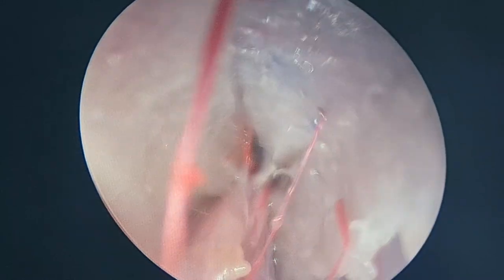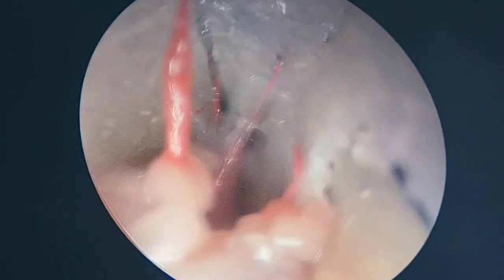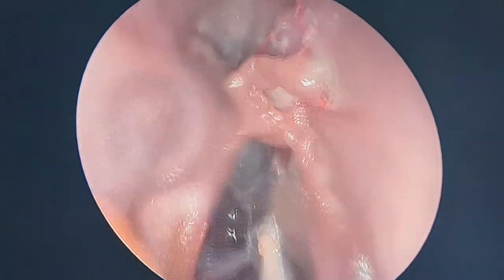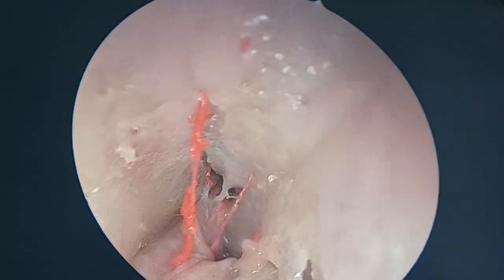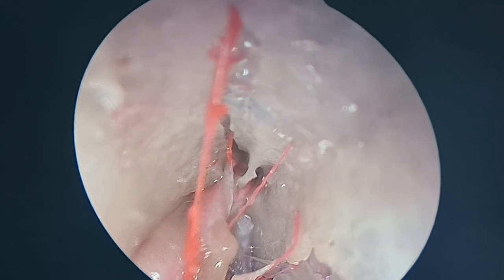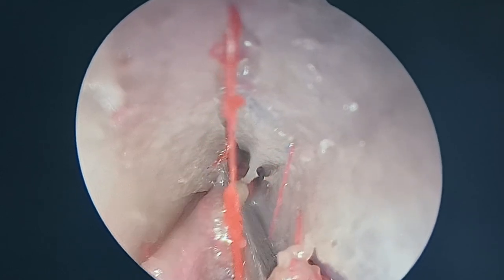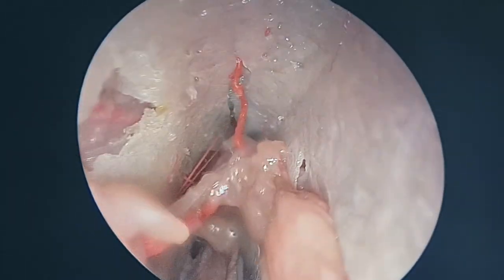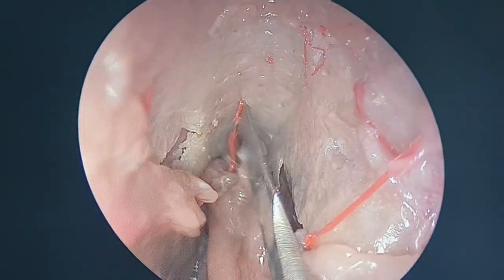And don't get confused with anything. Another branch of the anterior ethmoidal artery. The vessel is always lateral. See that? And the fiber is always medial. Medial and behind. The fiber is always medial and behind. This is the vessel again here, and the fiber is always medial and behind. That is the first olfactory fiber. So all my Draf dissection will be staying anterior to it.